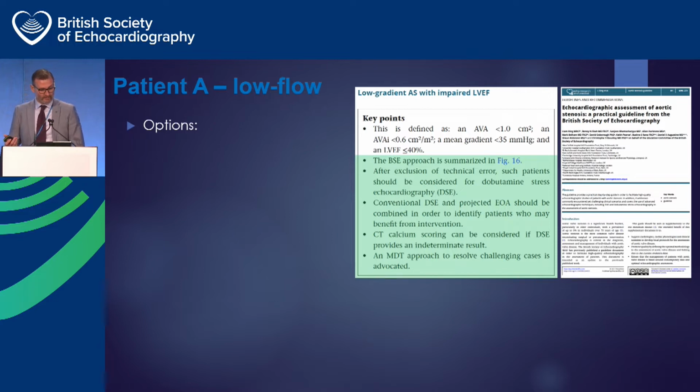So my colleague came and asked what we should do with this chap next, and all of the answers to your AS questions are in the AS guideline that Liam wrote. It's a brilliantly comprehensive guideline that gives you tips and guidance on every scenario for aortic stenosis.